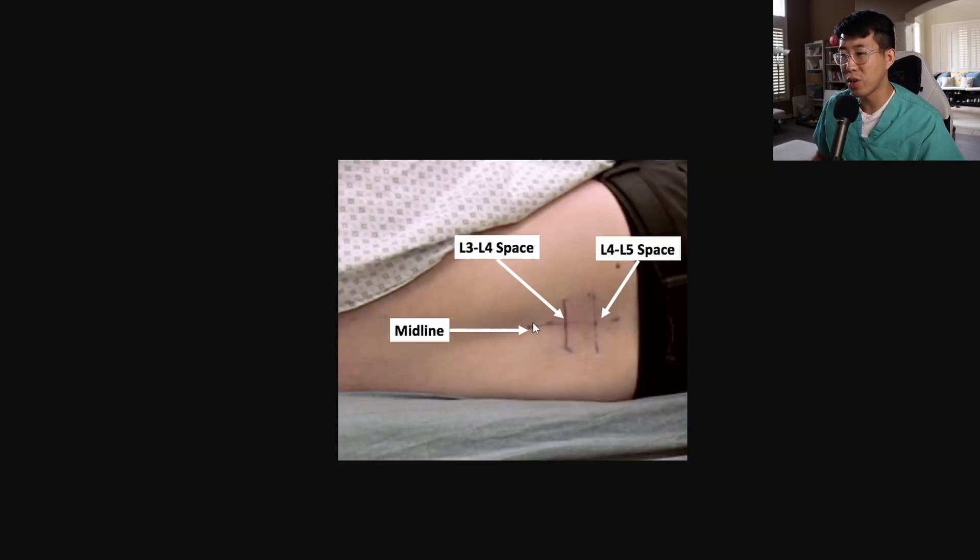Tip number four is to draw your landmarks very liberally. Get those surgical markers, and honestly, if you have to draw a huge line down the patient's back to keep track of where midline is, that is totally fine. Don't be embarrassed — if it improves your success rate and improves patient comfort by getting it earlier without struggling, it's totally worth it. Here you can see an example of somebody really marking out their spaces clearly: midline, L3-L4 space, L4-L5 space. You can even extend markings higher up, as it's much easier to palpate the spinous processes there, helping you remember what's in the midline.